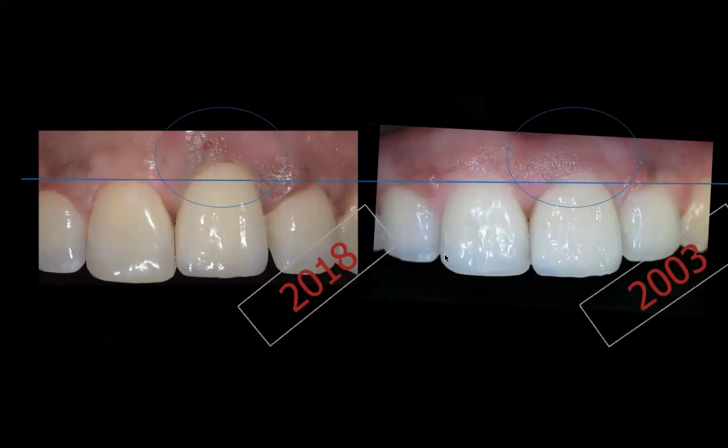It's hard to see from this picture, but I'm not sure if that space was there. But in any event, teeth do grow and implants don't. That's one of the challenges in the aesthetic zone that we have to address. But what happened here? What could have gone wrong?